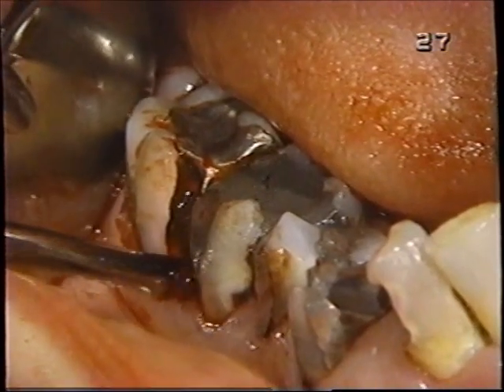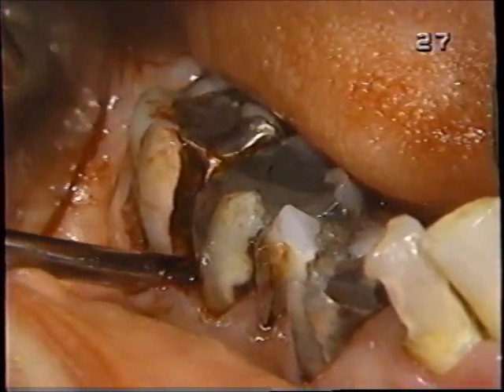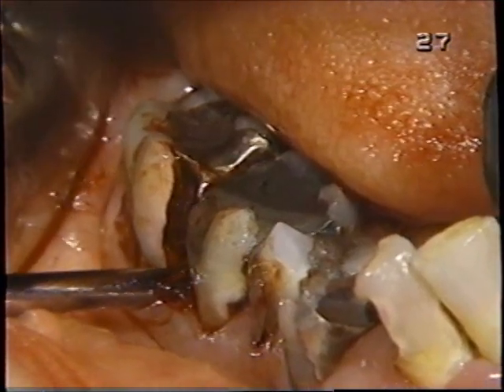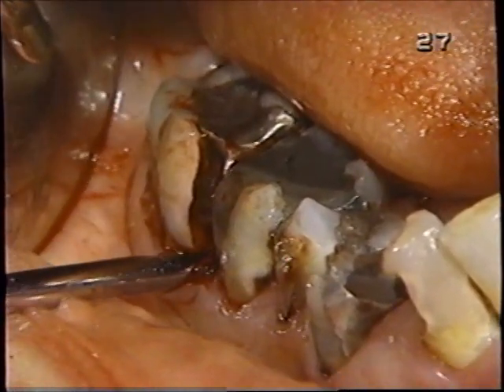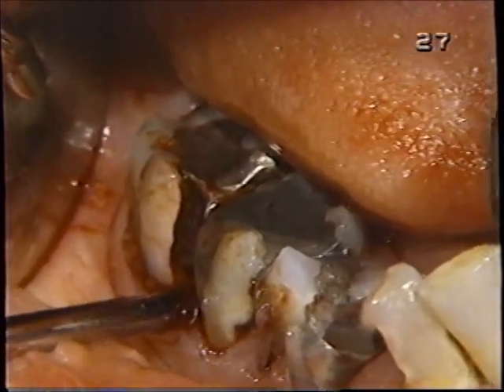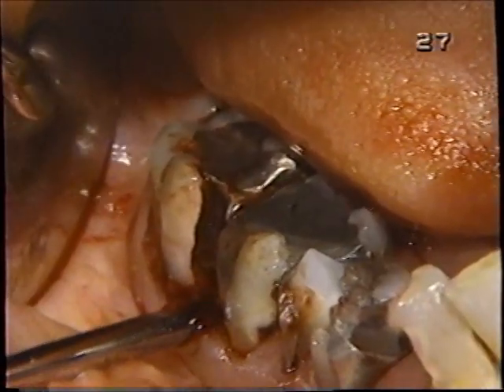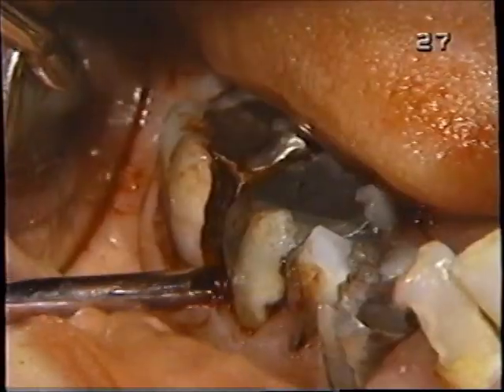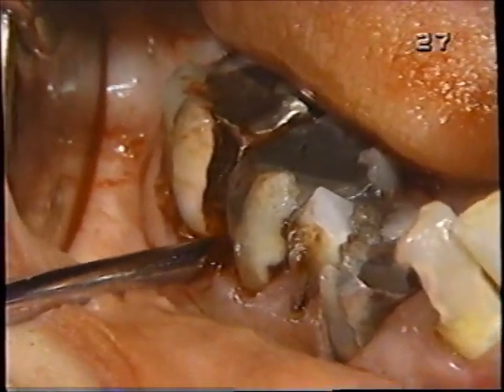Next thing we want to do is do some luxation here with the 301. Now, we want to have the fulcrum of the elevator on bone, interseptal bone. And as I'm wiggling, I can see that most of the movement here is the tooth in question, the second molar. And I don't see the first molar moving, fortunately, when I'm doing this. And I'm trying to luxate, which involves expansion of bone, disruption of periodontal ligament. I think that's all we're going to get out of this.